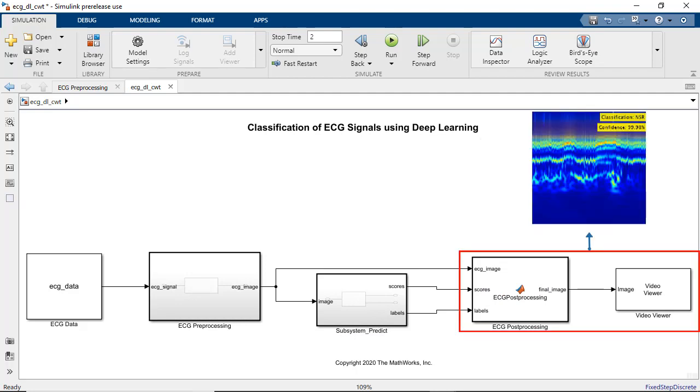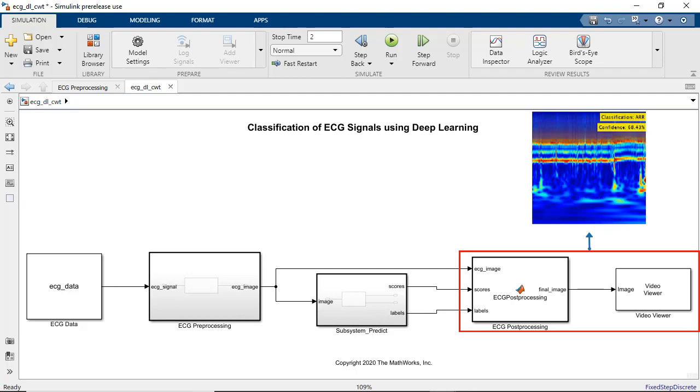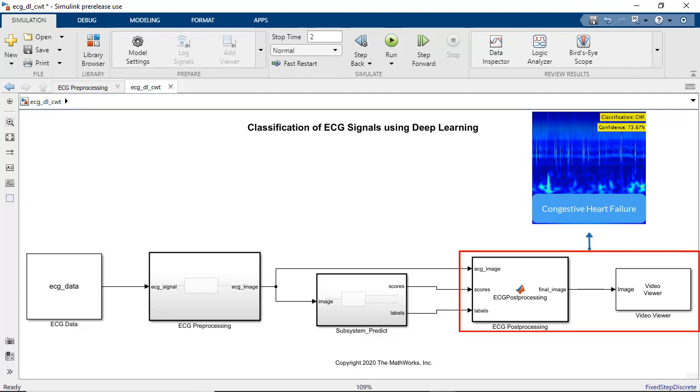ECG post-processing subsystem then finds the label for the ECG signal based on the prediction score from the SqueezeNet and outputs the scalogram image with label and confidence score printed on it.